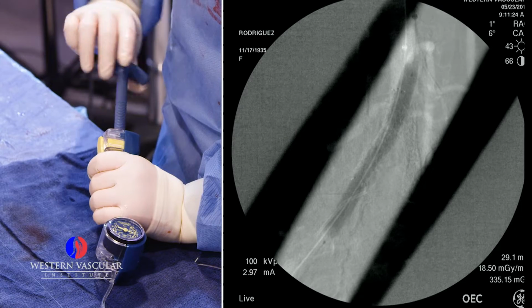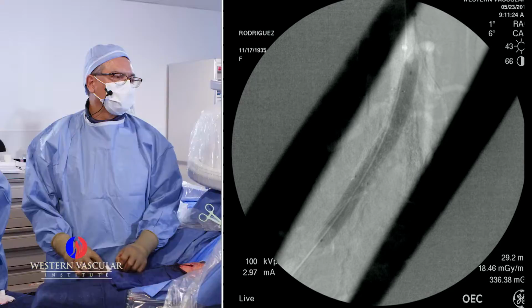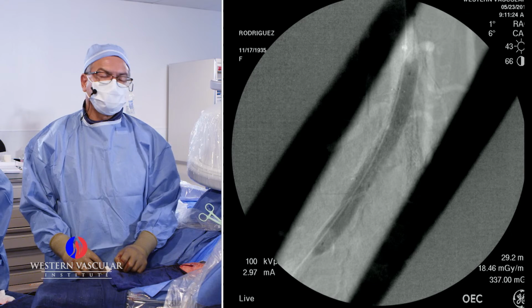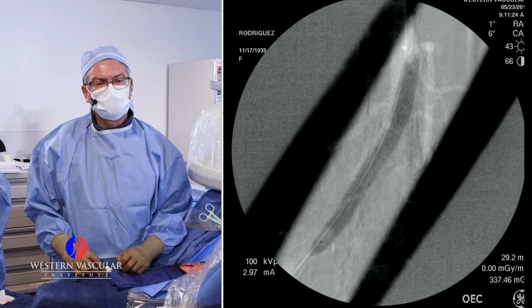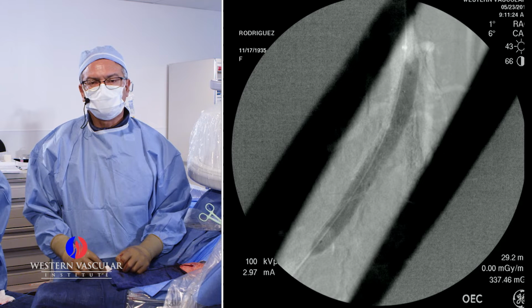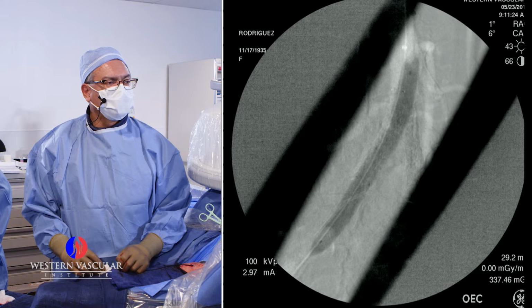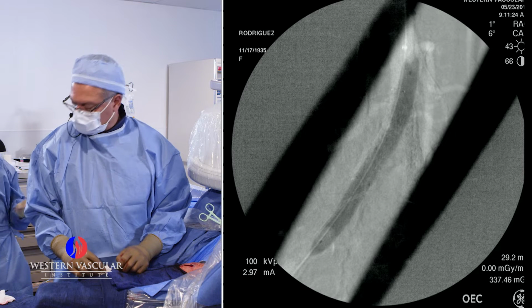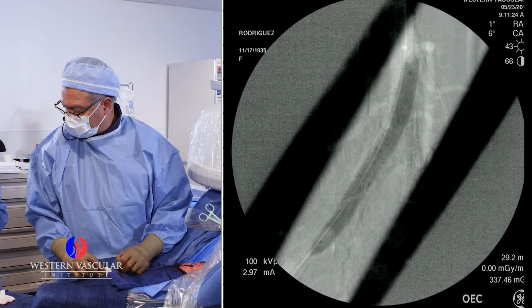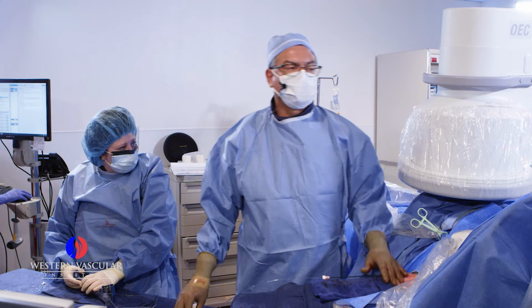The patient sometimes feels this ballooning, a little back pain. We're doing this procedure actually with local anesthesia and conscious sedation. It's a sedation, so it's kind of sleepy. And you can see we have a good expansion of a stent right there. Let's do it for a minute, please. So we keep the balloon inflated for 1 minute.